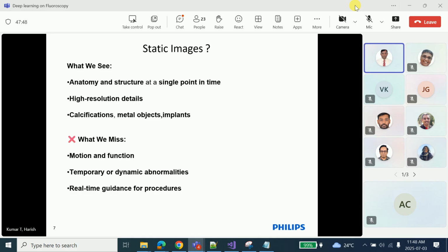High resolution, as I told you, radiographic images have a higher radiation dose. Higher the power, higher the dose, better the image quality. So it does not mean that every time I go and give a high dose to the patient. No, it's not like that. Radiology is all about the ALARA principle, as low as reasonably achievable. You do a fluoroscopy, you do a radiographic image, but you do it at the minimal dose to get the maximum benefit or the maximum image quality. This is the principle that everybody in radiology will always follow, called the ALARA principle.